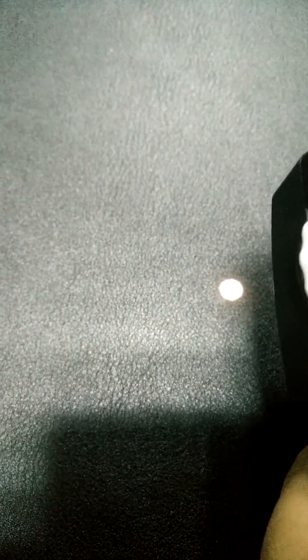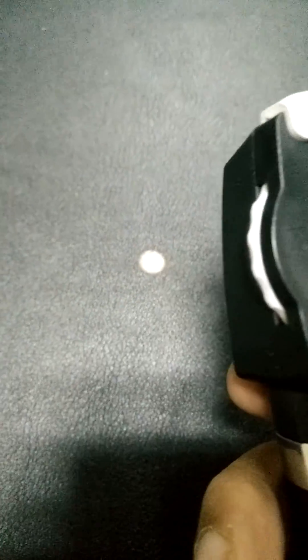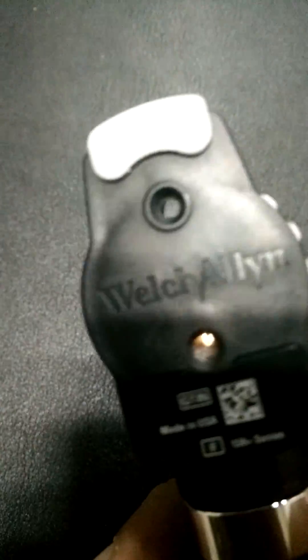This is with the filter off. This is with the filter on. There is a very slight difference. I prefer to keep it on because I have seen that it does slightly reduce the corneal glare and it is much more comfortable for the patient.